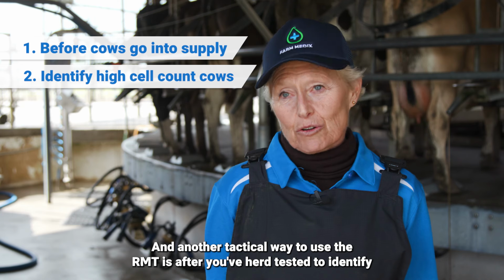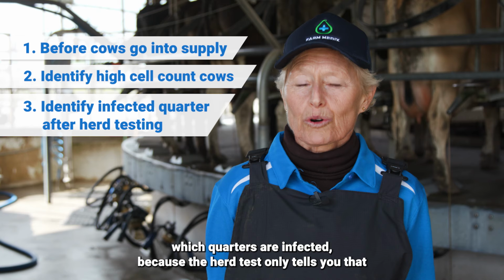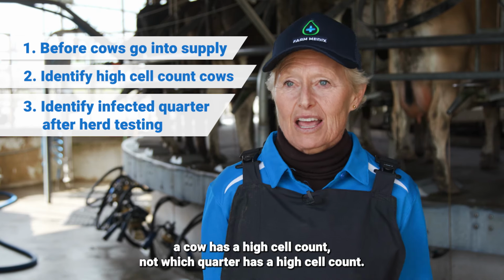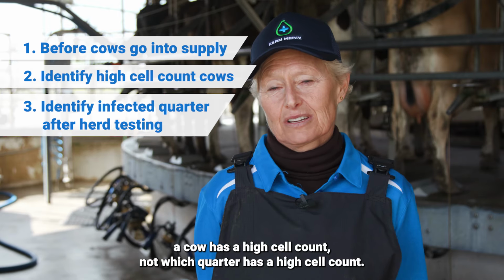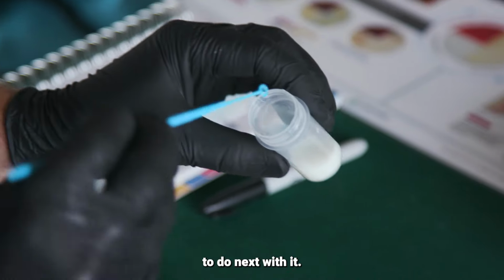And another tactical way to use the RMT is after you herd test to identify which quarters are infected, because the herd test only tells you that a cow has a high cell count, not which quarter has a high cell count. And then you can address the quarter with a culture to determine what to do next with it.